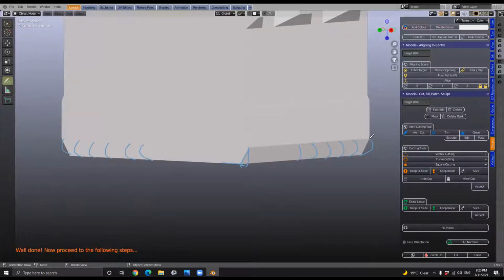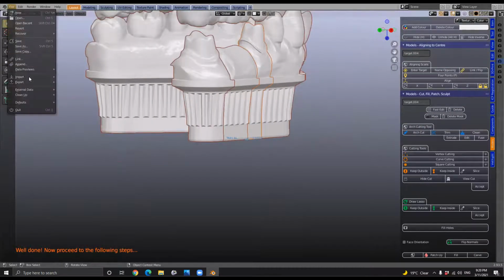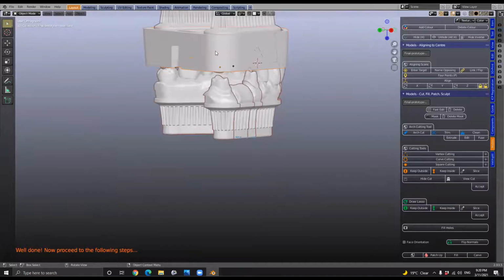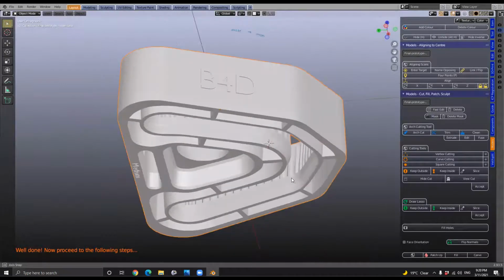The other important thing to note is that you've taken the burn layer to clip into the VertXsplit, and this is the unique thing because you've actually made that part of the clipping device. Can you explain that a little bit? Yes, so the underside of the plastic injection mold has got a recess that angles in the other way. And that swelling will then just push into that. So that kind of causes that clip. So if you were hypothetically to sand all of that away, you won't have that mechanism. You'll lose it.